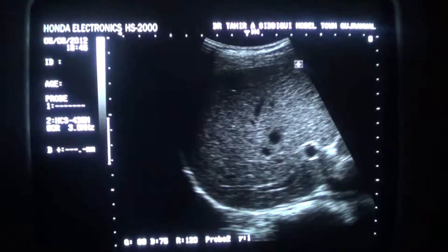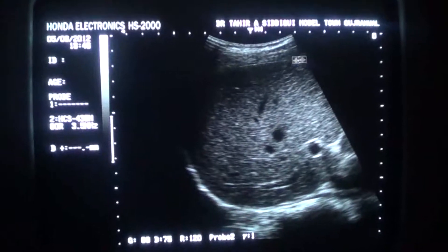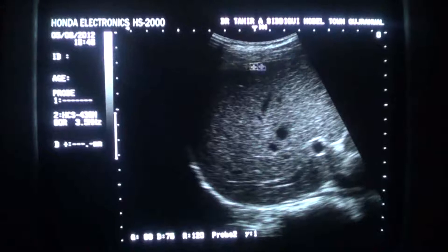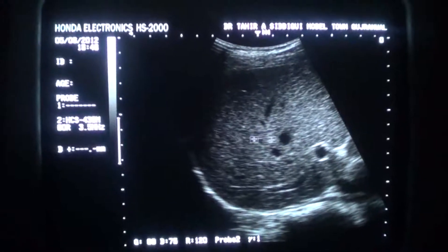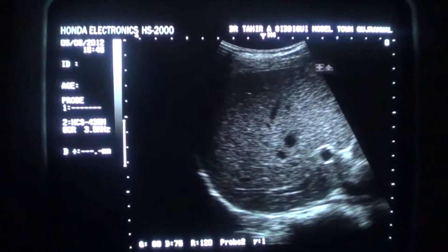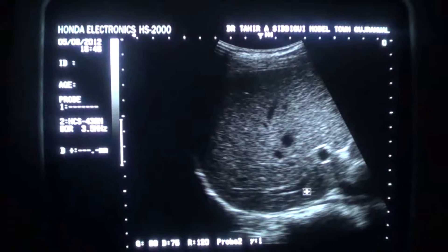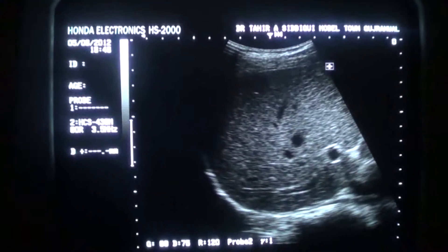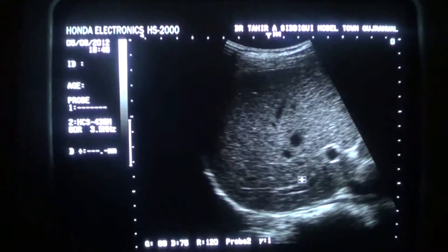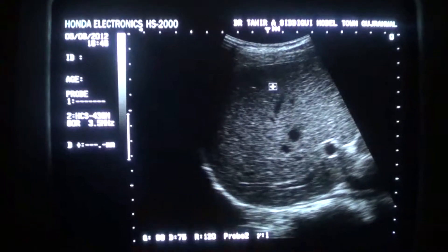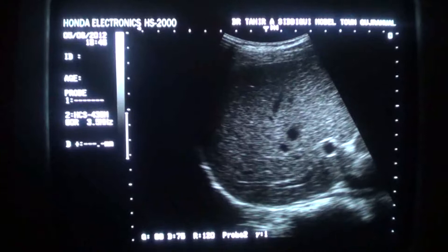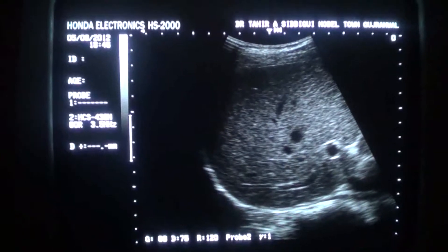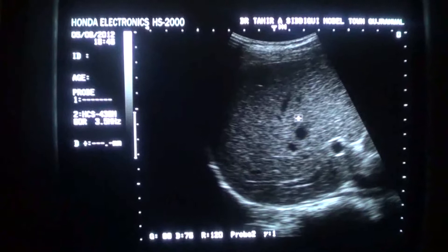This also gives you an opportunity to see the outer surface of the liver, which is normal — how it will normally look like. It will give you an opportunity to see most of the right lobe of the liver in total, to see the echogenicity — that is, the echo-brightness and the echo-texture: smooth, uniform. It will also give you the opportunity to see the vessels.